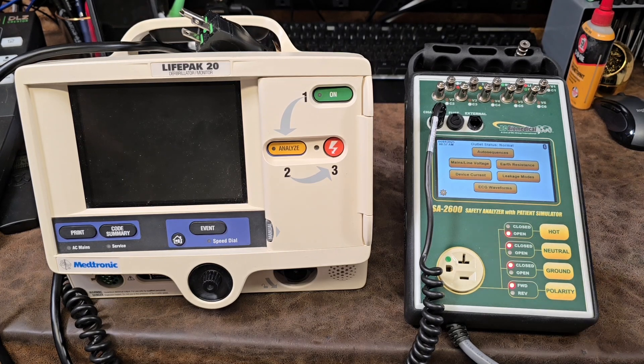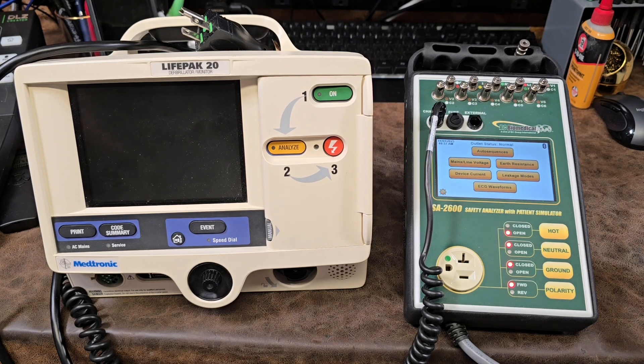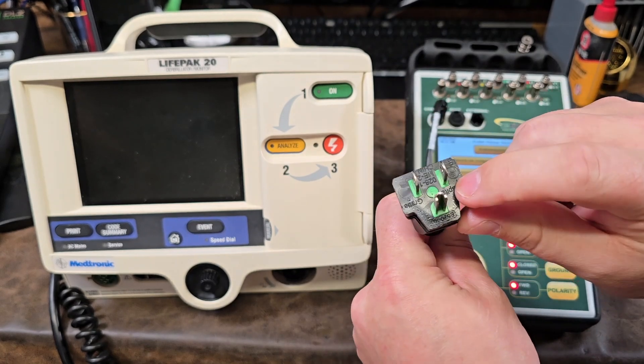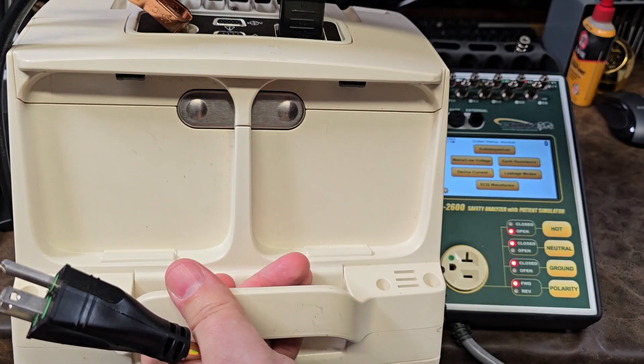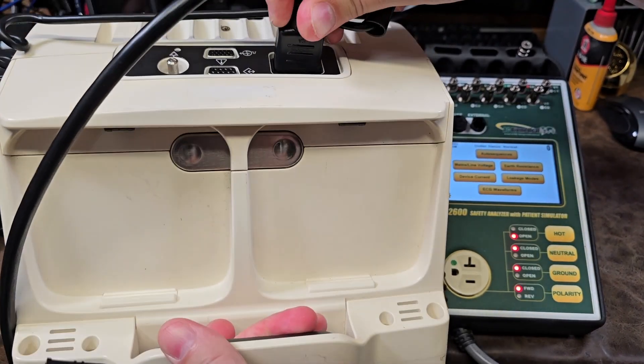This is a pre-programmed auto sequence. So first, any electrical safety starts with checking the power cord. Make sure that we have a medical grade power cord indicated by the green dot. Then we're going to check the IEC connector to make sure we have a snug and tight fit.